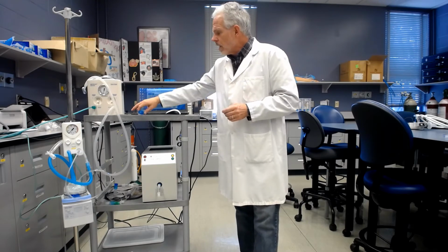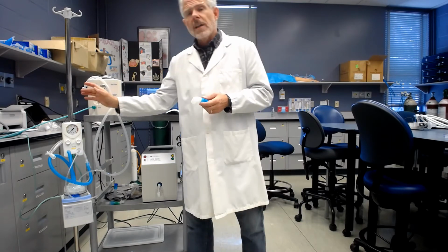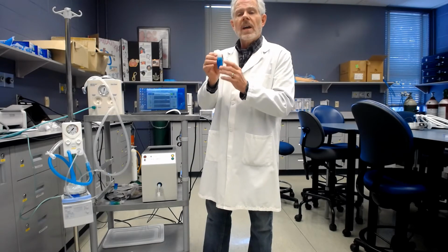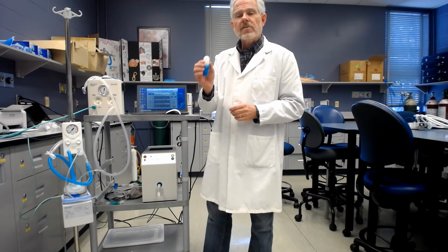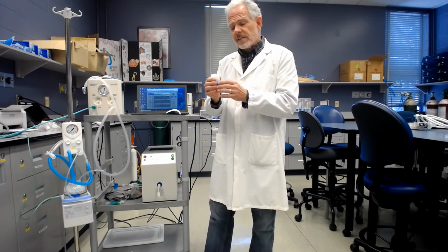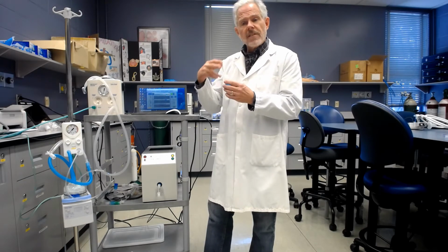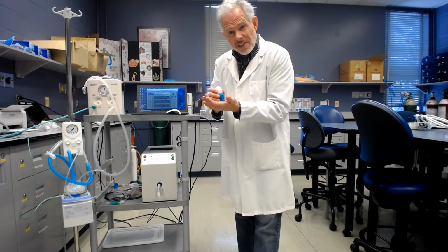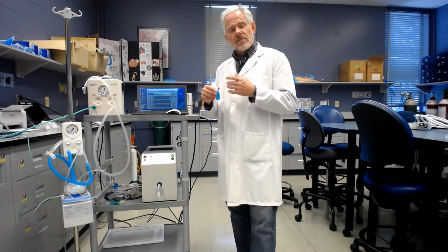And I'm also going to compare how effectively CPAP is delivered, because something the rPAP does, which a Neopuff does not do, is it has neonatal nasal prongs or neonatal masks that can fit on the baby. And I'm going to compare that both with a sealed system and a system with a significant leak.